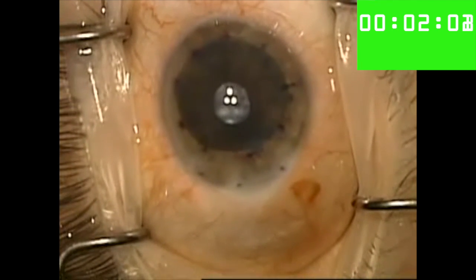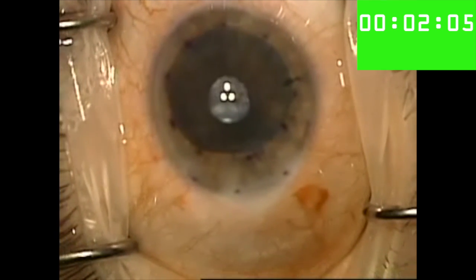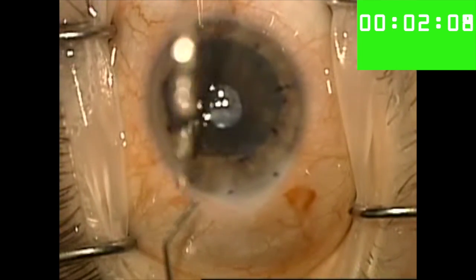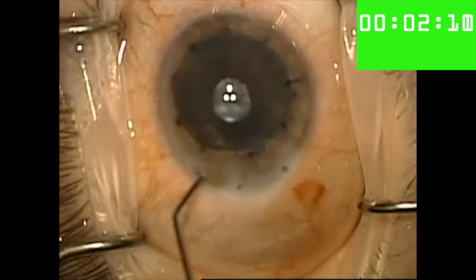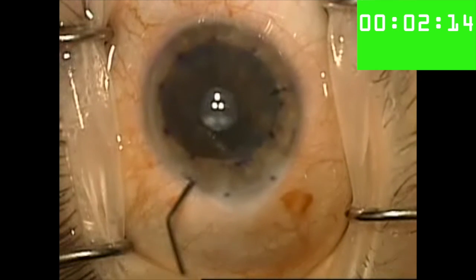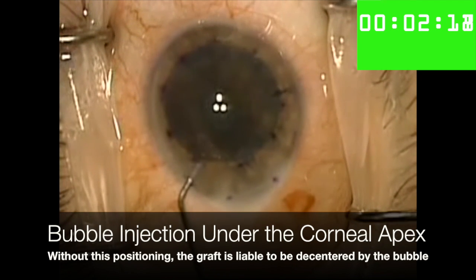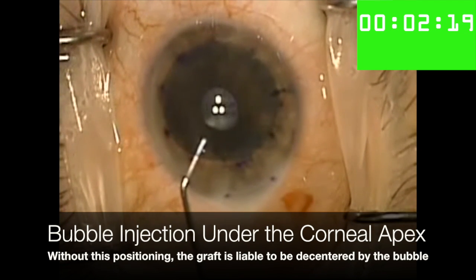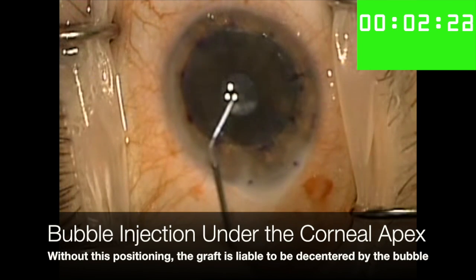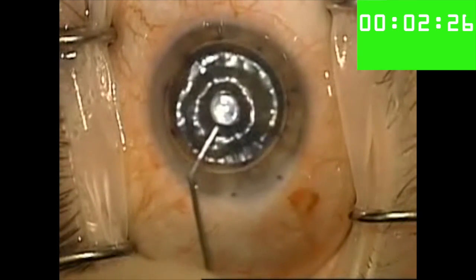And now with the DMEK graft well positioned and perfectly within our marks, we're ready to inject the SF6 gas bubble. We do this with a 27-gauge cannula on a TB syringe and introduce the cannula through a paracentesis that is in no danger of interfering with the graft. Before injecting the bubble, I make sure that the tip of the cannula is right beneath the corneal apex and that the eye is looking straight up and not torqued in any way. Any deviation from this position could result in the bubble pushing the graft off of the center marks.